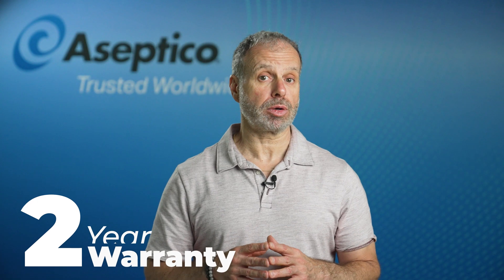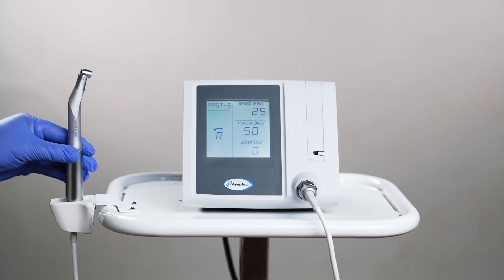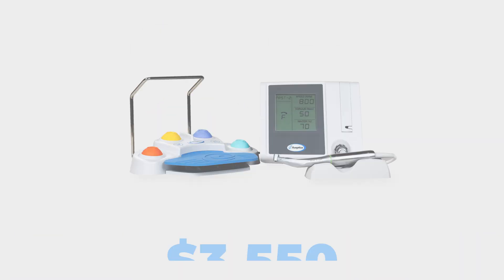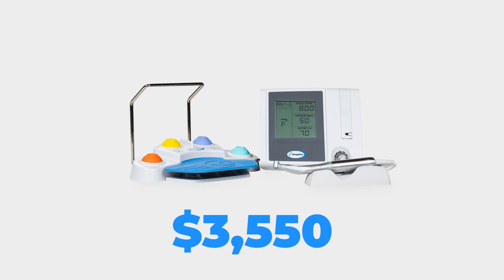It is backed by Asseptico's two-year equipment warranty and one-year warranty on handpieces. The Asseptico 1070 series implant motor package, including the AHP85MB-X Mont Blanc 20 to 1 handpiece, is available for only $3,550.